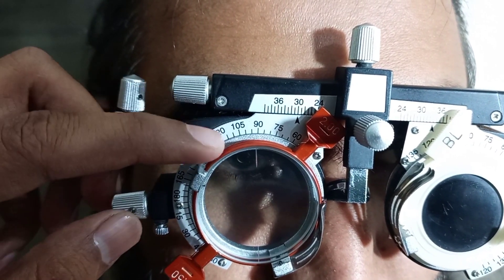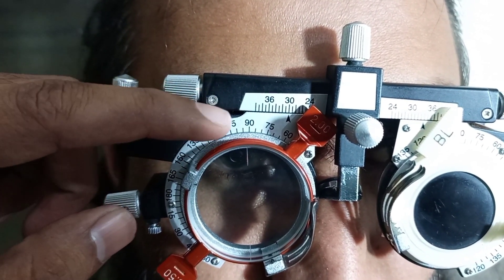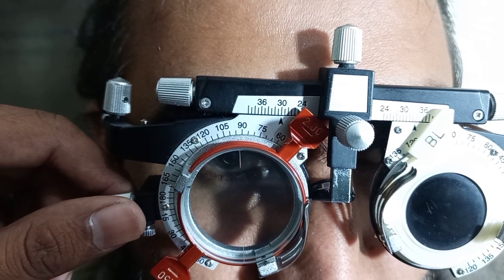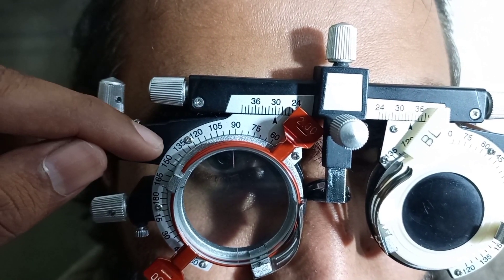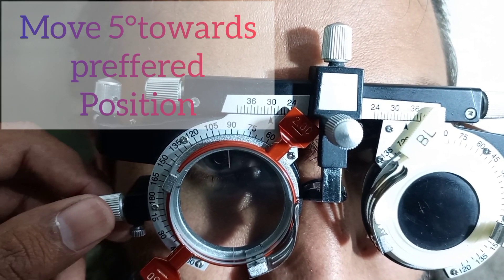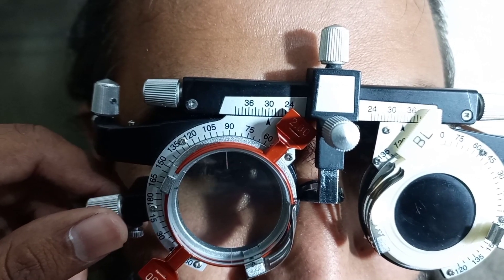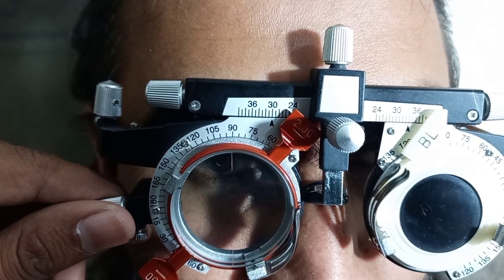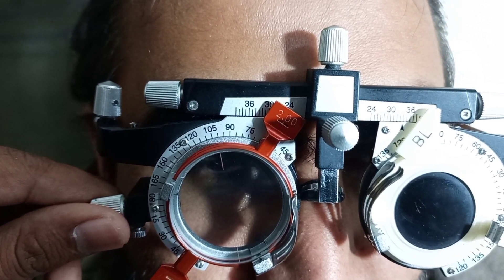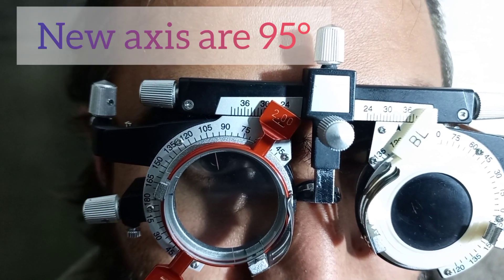We will move our trial cylinder — which axis is at 90 degrees — toward the preferred position. As our patient preferred the direction of 135, we have to move 5 degrees toward the preferred position, moving from 90 to 95. So our new axis is now 95 degrees.